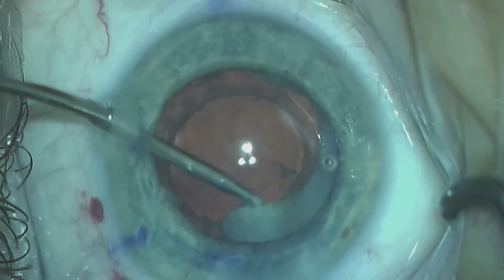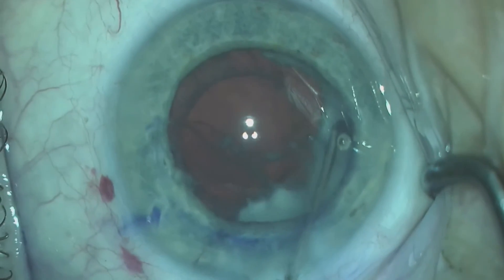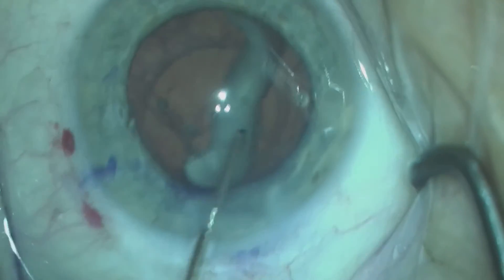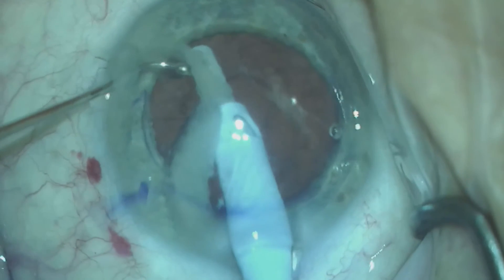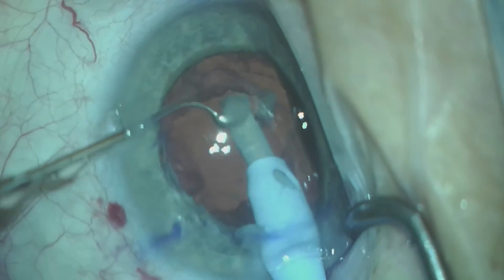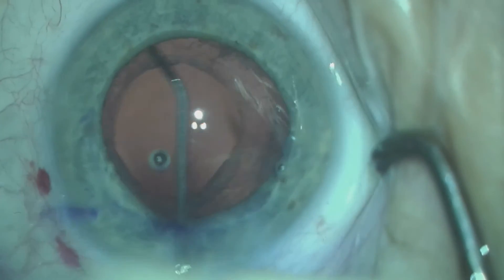At this point, I try to remove the residual cortex with the MST forceps, but that was unsuccessful. I go in and visco-dissect out this cortex from the fornix of the capsule. Irrigation aspiration is used to clear this remaining cortex from the eye. Once again, this is an open capsule in a post-vitrectomized eye, so thankfully I did not need to perform a vitrectomy. However, we did have concern throughout the entire case that either the lens or the cortex could fall posteriorly.